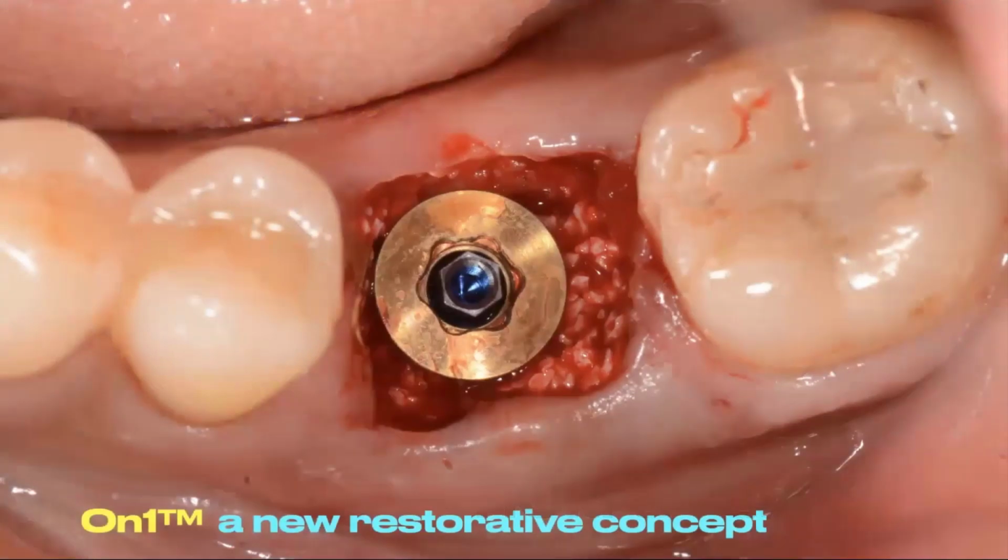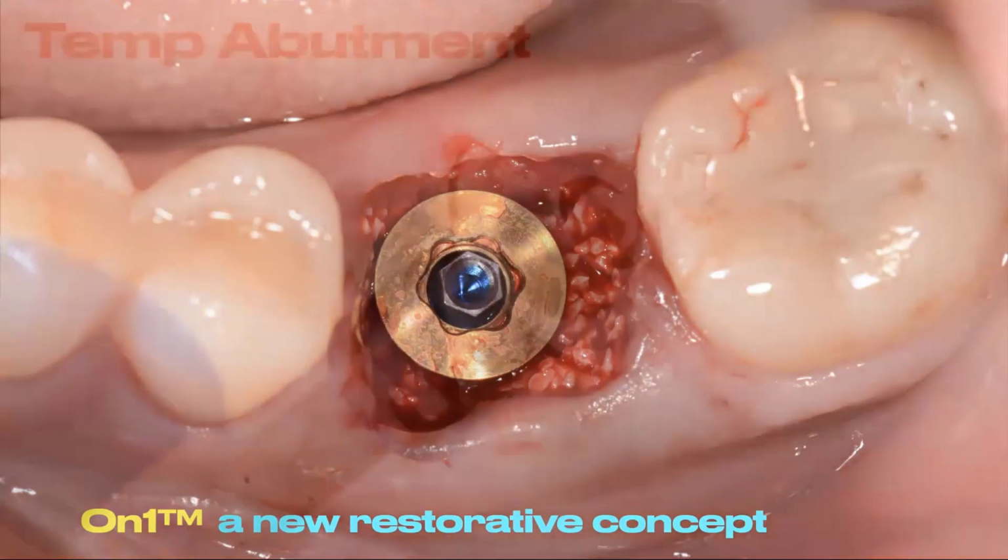And so we put that in. You can imagine we planned this on the software. So we planned this in our cone beam CT derived workflow. And so not only do we plan our implant placement, we also plan to have this abutment in. So we had to plan the proper depth of implant placement, and we had to make sure there's enough room for the restorative materials, right, for something like this.